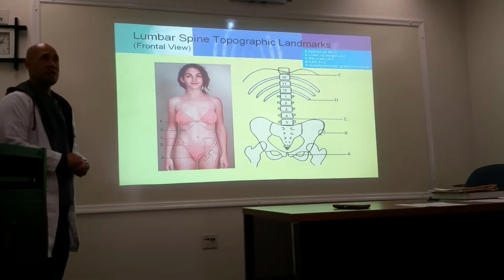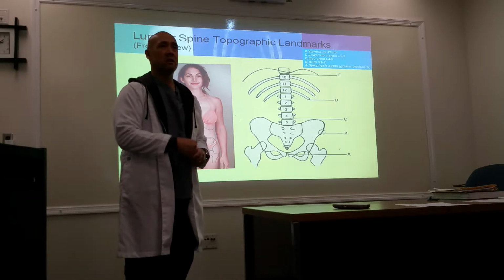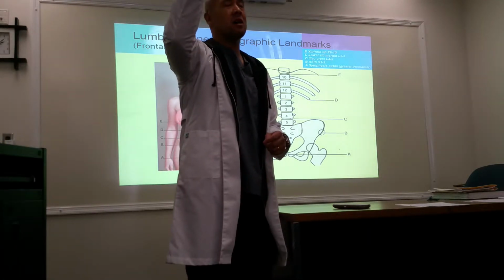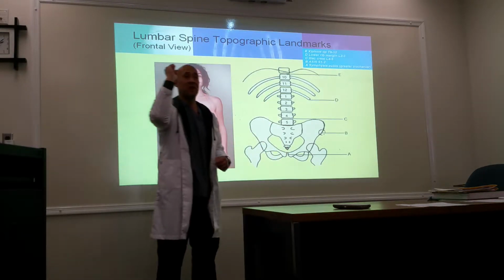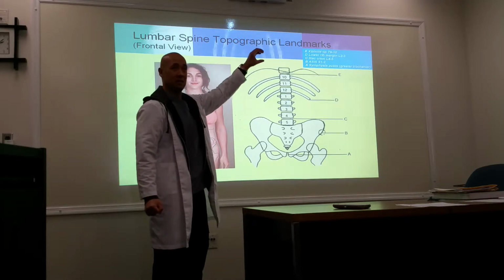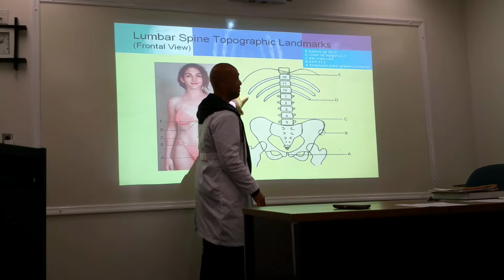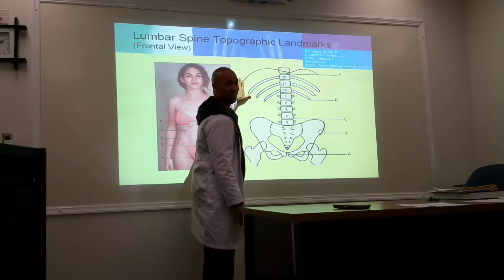And are we all familiar with the ASIS? How many of you have seen a lumbar series or have done one? Does your series include an L5S1 spot film? Yes, we call it a spot film. Have you been shown various techniques of how to find L5S1? Some of you are doing this, and there's also this one, and this one too.